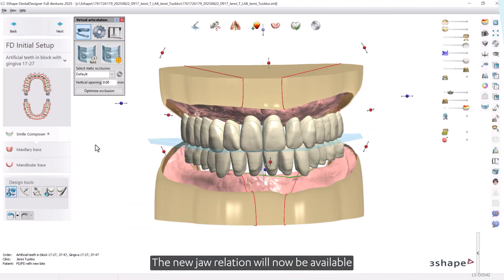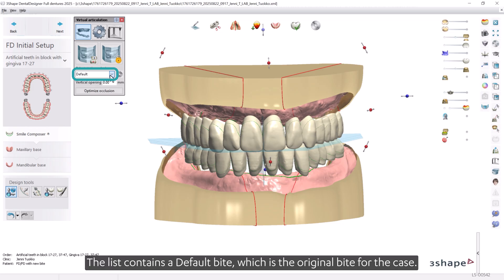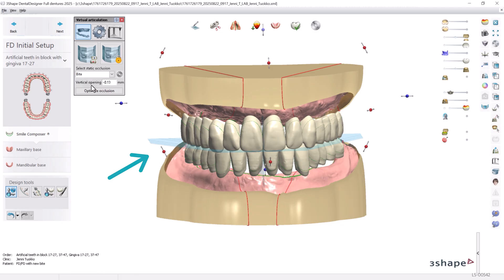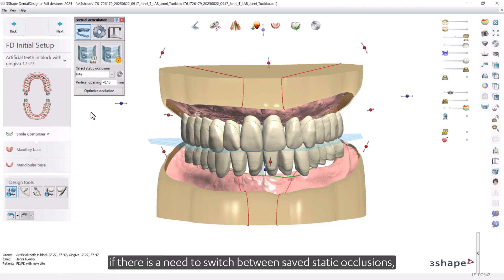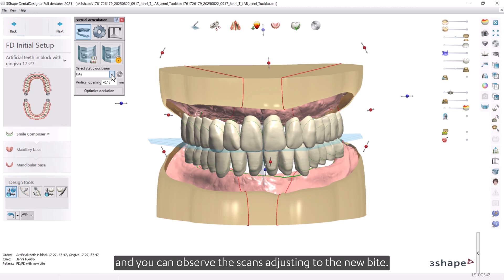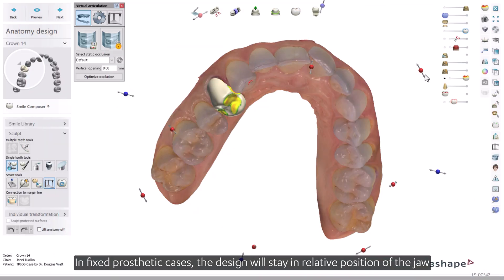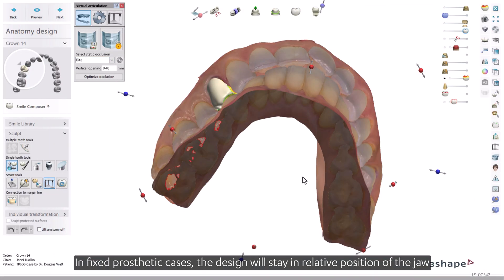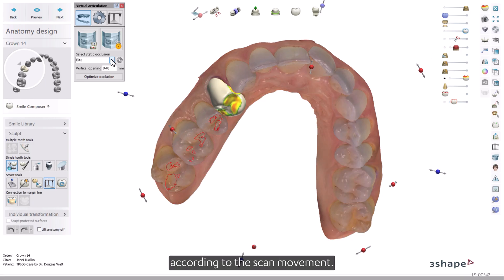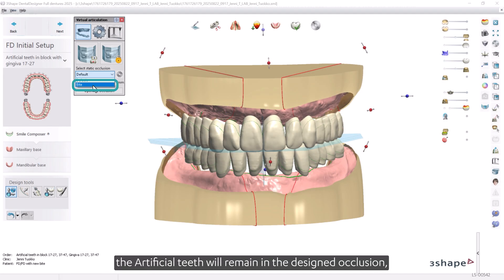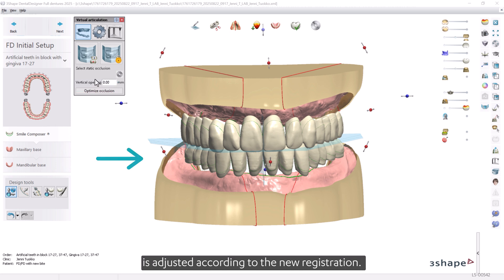The new jaw relation will now be available in the Select Static Occlusion drop-down menu. The list contains a default bite, which is the original bite for the case. Any new and saved jaw positions from the Bite Aligner will appear as a bite with a numerical extension. Any time during the design workflow, if there is a need to switch between saved static occlusions, the bite can be selected from the Static Occlusion menu and you can observe the scans adjusting to the new bite. In fixed prosthetic cases, the design will stay in relative position of the jaw it is done on and will move in the new bite relation according to the scan movement. In removable prosthetics cases, the artificial teeth will remain in the designed occlusion as the relative position of the lower jaw is adjusted according to the new registration. If needed, the teeth arrangement can be adjusted manually.